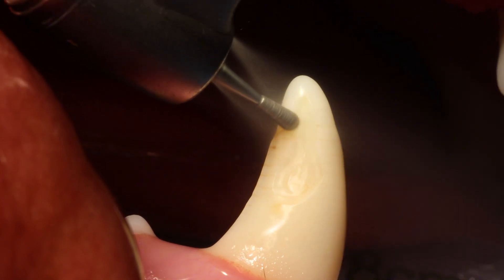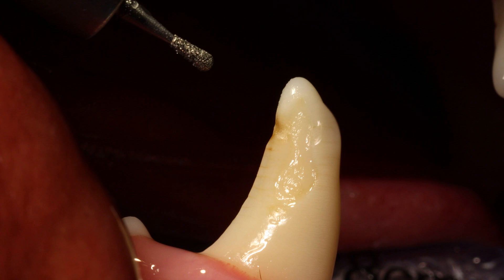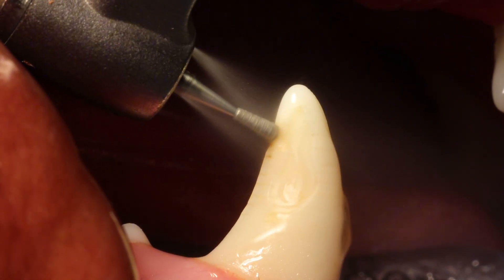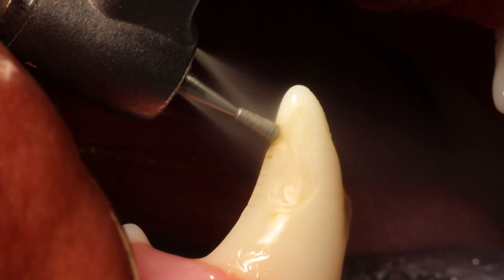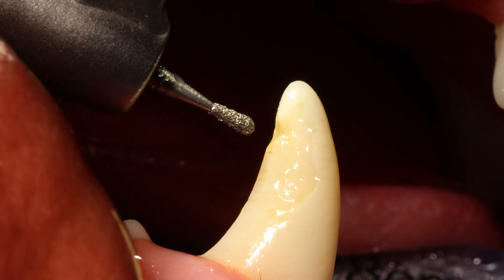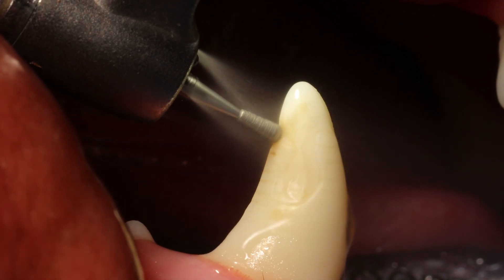If you use a medium or coarse diamond burr, your restoration will attach a little bit better compared to using a very fine diamond. I'm trying not to take too much tooth substance away, but enough to get rid of that diseased and loose enamel and dentine.